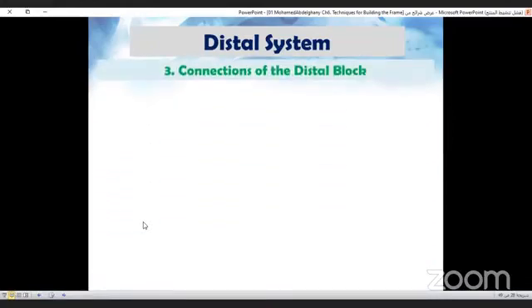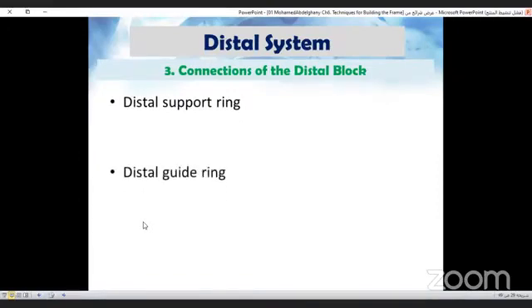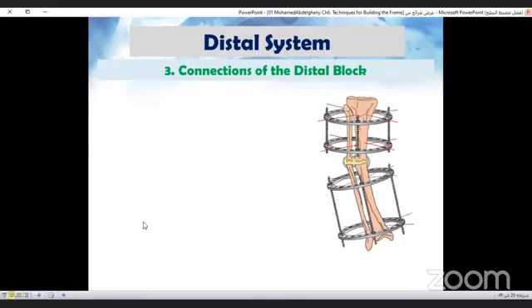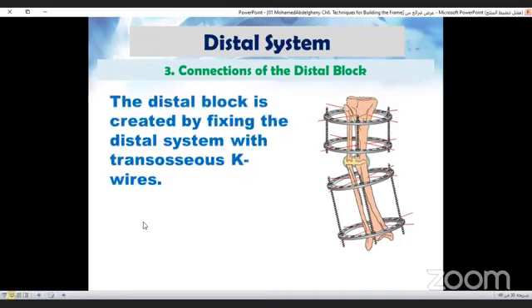Now we come to the connections of the distal block. If we connect the distal support ring and the distal guide ring with three or four threaded rods, we now get the distal system. Finally, the distal block is created by fixing the distal system with transosseous K wires.